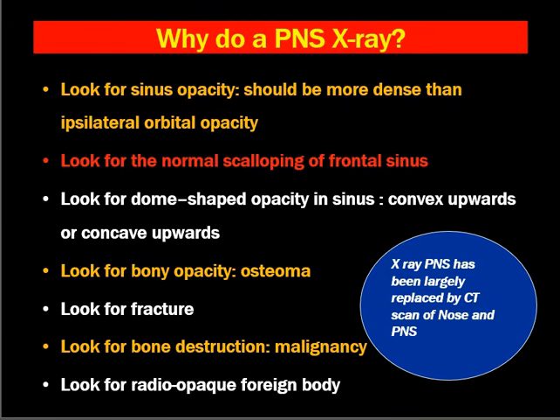But like the X-ray of the mastoids, the X-ray PNS has also largely been replaced by CT scan of nose and PNS. This is the most commonly performed investigation for nose and PNS conditions nowadays.